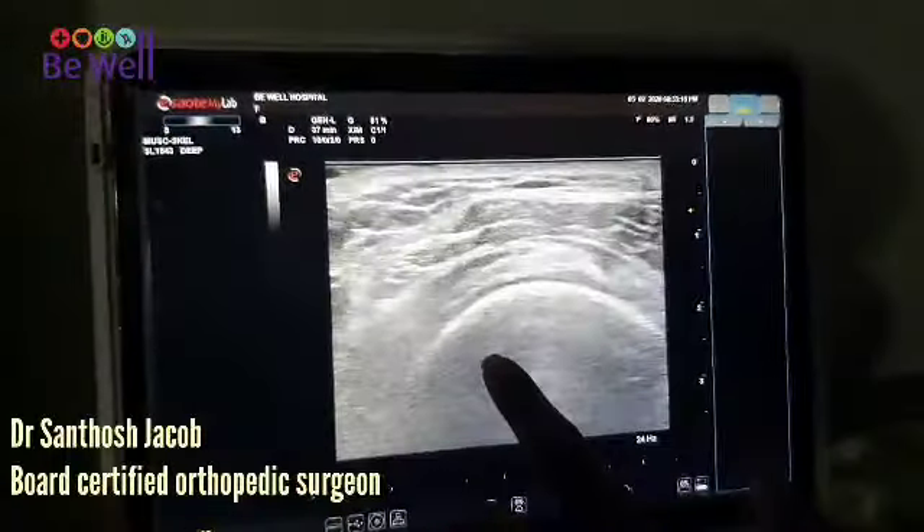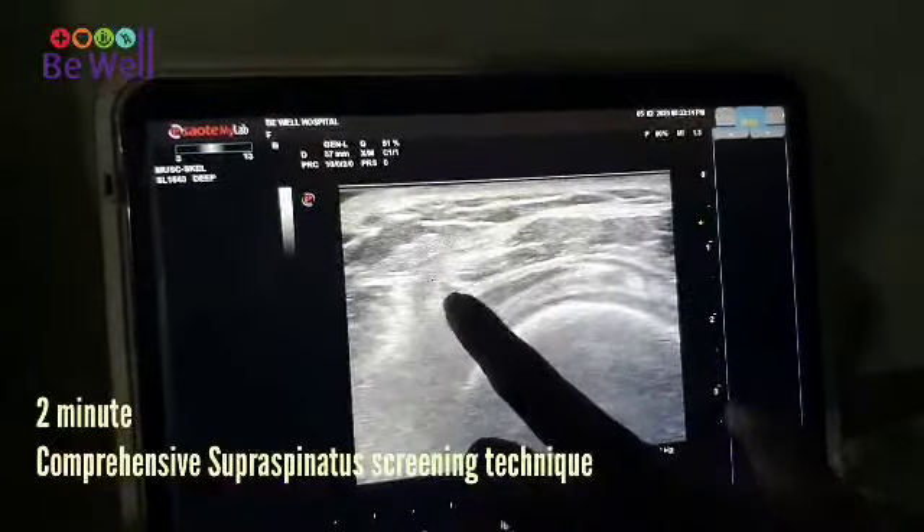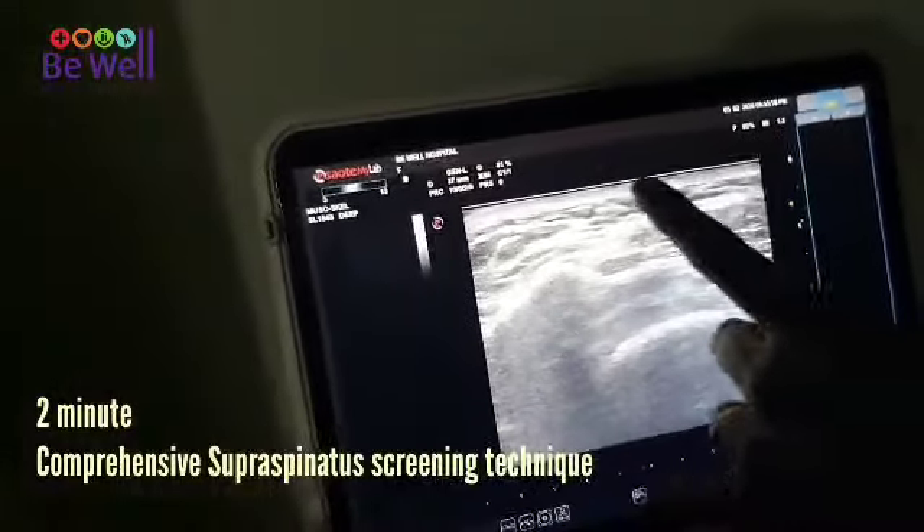So as you can see, this is the humeral head. This is the rotator cuff. This is the bursa. This is the deltoid. This is the fat. This is the skin.